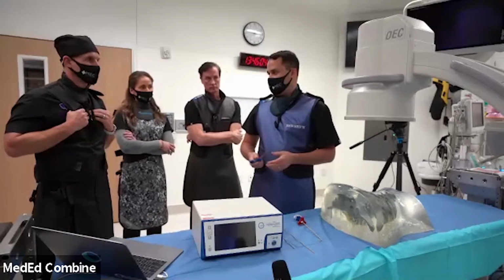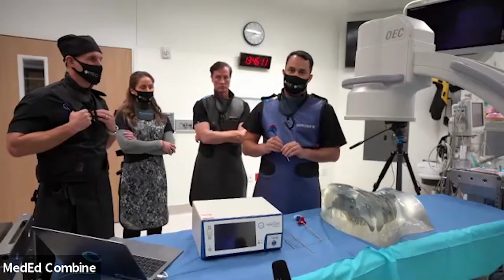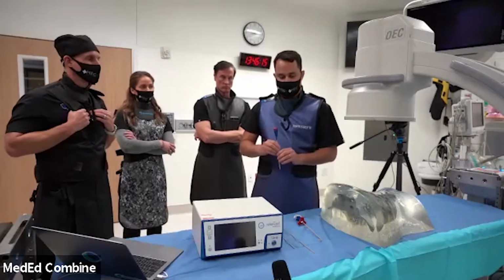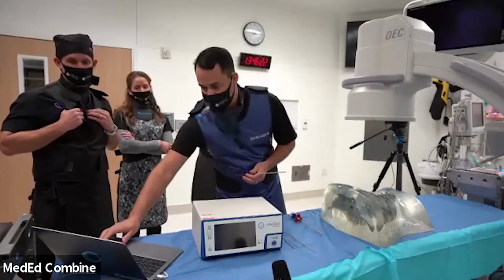So I train Intracept, and I always tell people, I'll let you go first, but you have to be perfect. So instead of going right down the barrel of the pedicle straight down, you want to start from superior lateral to inferior medial, because that'll give you the best track to get to where that basivertebral nerve lies. So we go down through the pedicle, and actually we have some slides here I can go through too.